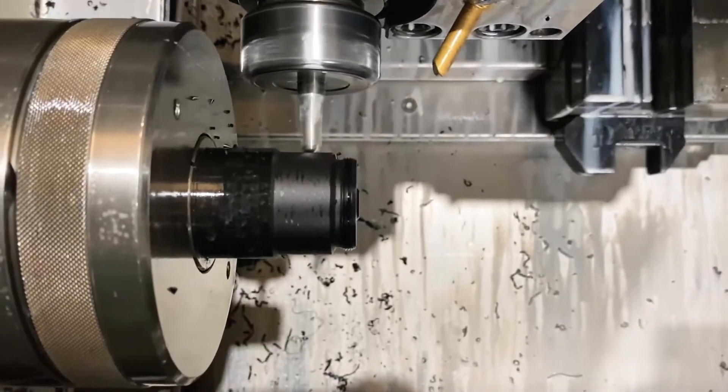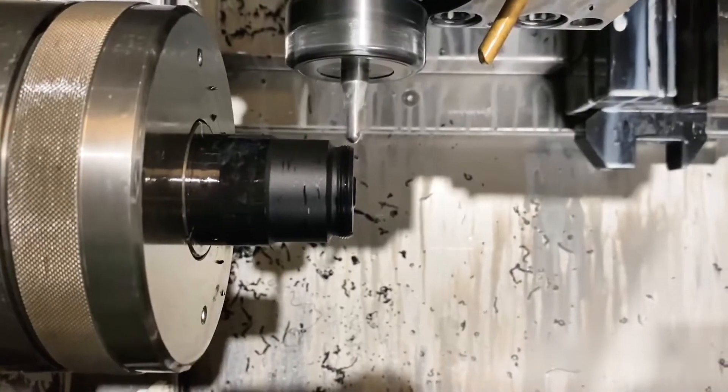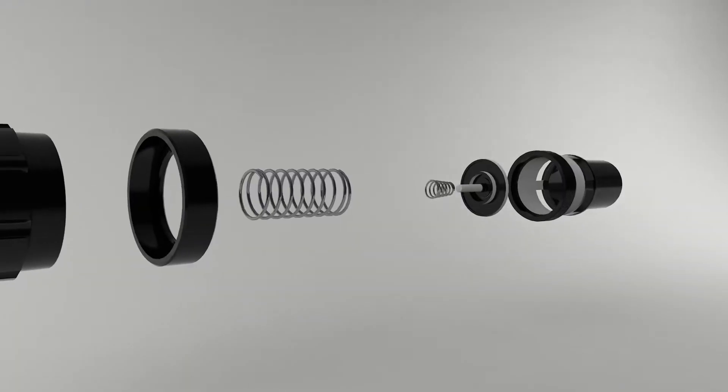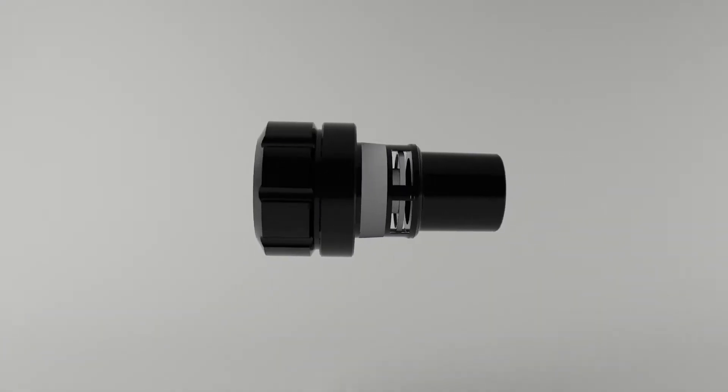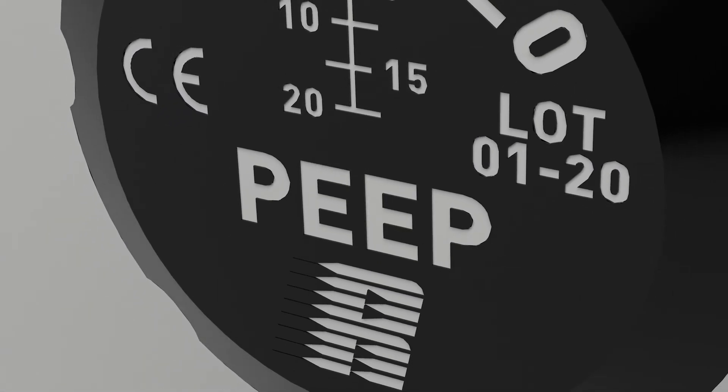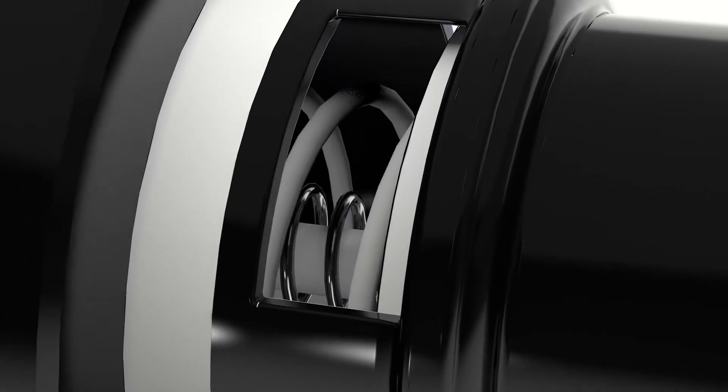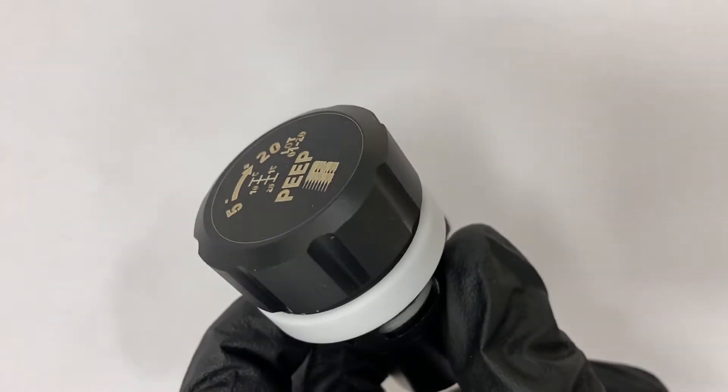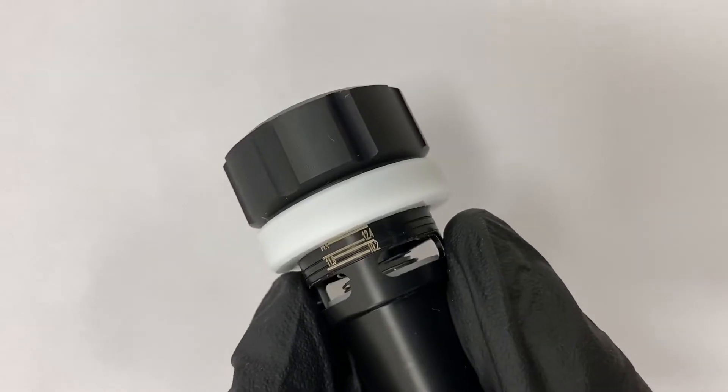It starts with a piece of polyacetal where we machine the surface with a high-precision CNC. We install a non-magnetic stainless steel spring created with an artificial intelligence machine. Afterwards, the spring is thermal treated into a process that helps the metal to remember the new position, achieving a high-accurate product.